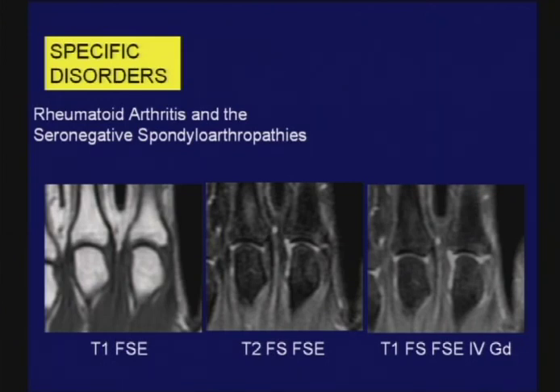Will measurements help us with regard to the thickness of the synovial membrane that we see? And the other problem I see is how many joints do you search in? How many sequences or planes do you use for each joint? Do you do both extremities together, or do you do one?